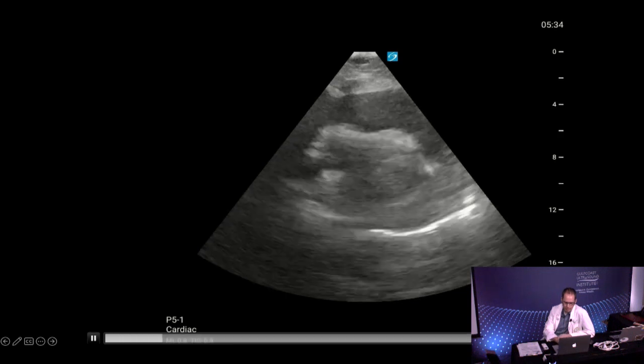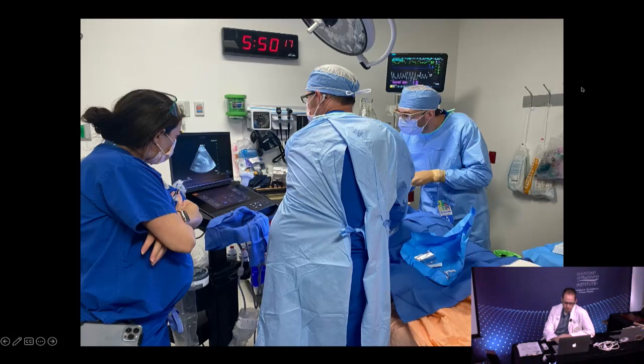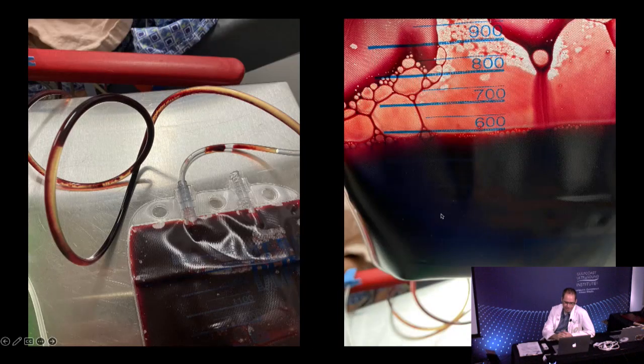with the pericardial centesis. So notice the time there, we're at 5:50, and we're finally getting to the pericardial centesis. So she's almost 3 hours into her visit when we finally get the actionable interventions that are going to save her life. So we pulled off a pretty significant amount of fluid. She had over 600 cc's of this serosanguinous fluid that we pulled out.